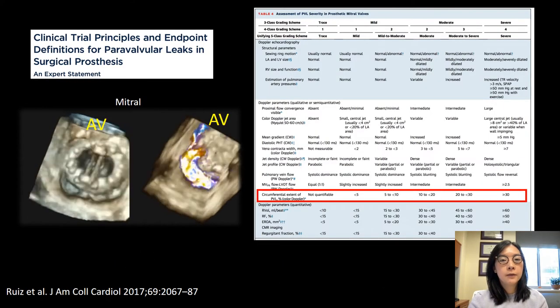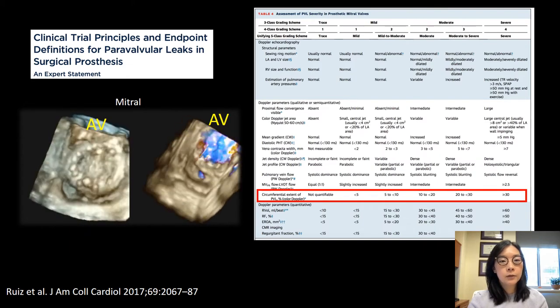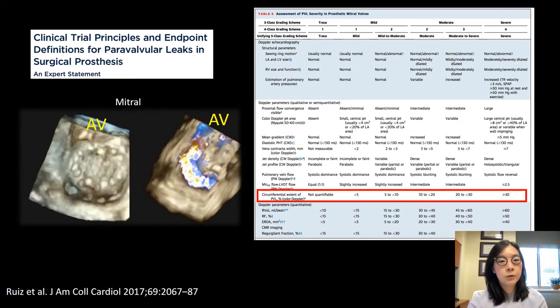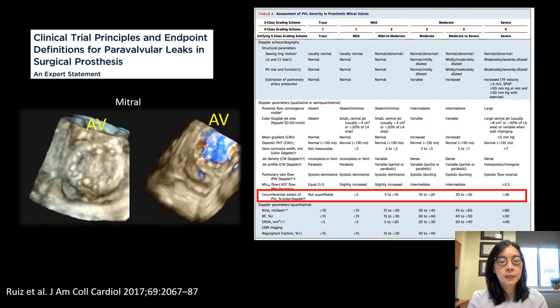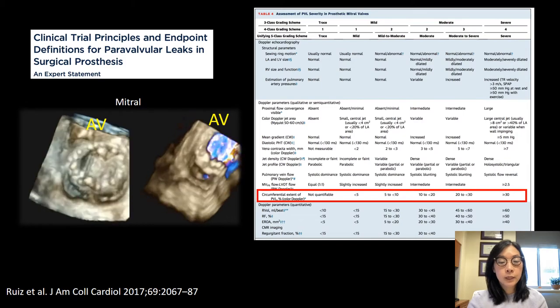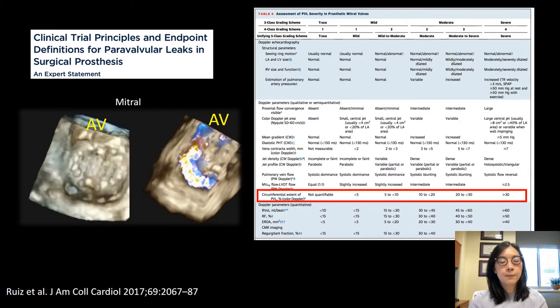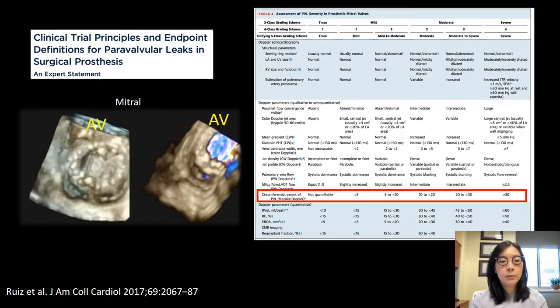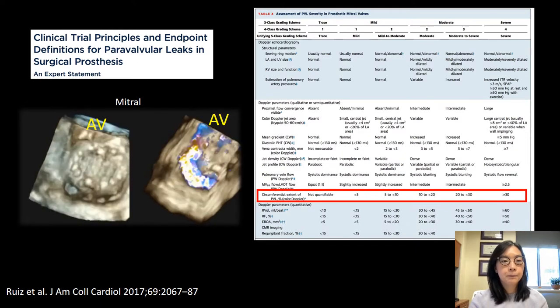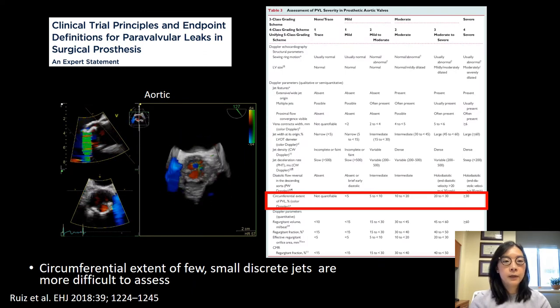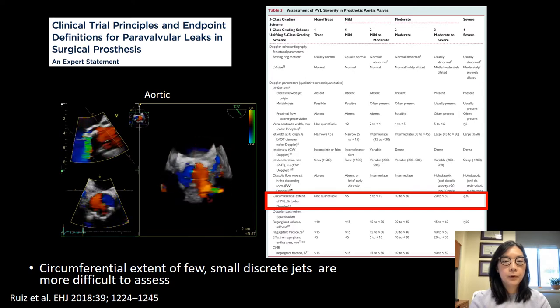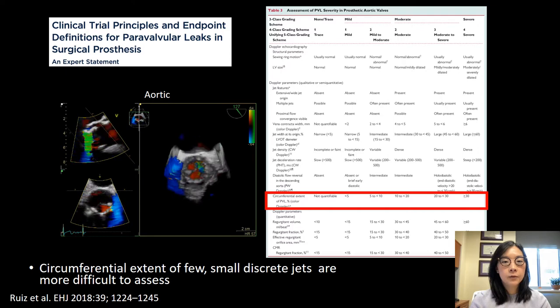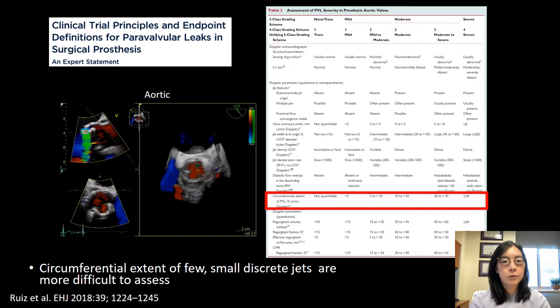Quantification of the severity of regurgitation in paravalvular leaks is very similar to that used for native leaks, except for the addition of the assessment of the circumferential extent. For the mitral valve, if the circumferential extent is less than 10% it's a mild leak; if it's greater than 30% it's severe. However, one limitation of the circumferential cutoff is that it doesn't take into account the depth of the leak — something less than 10% but measuring 10 millimeters in size would still probably be a severe leak. Similarly, aortic paravalvular leak severity follows native aortic valve regurgitation criteria, with the same 10% and 30% cutoff values.